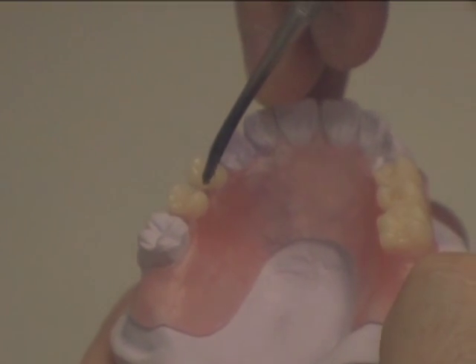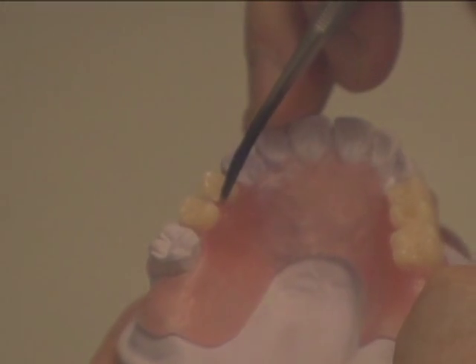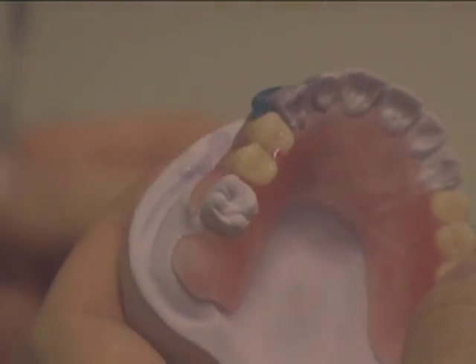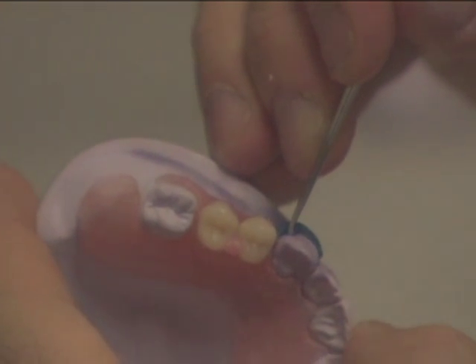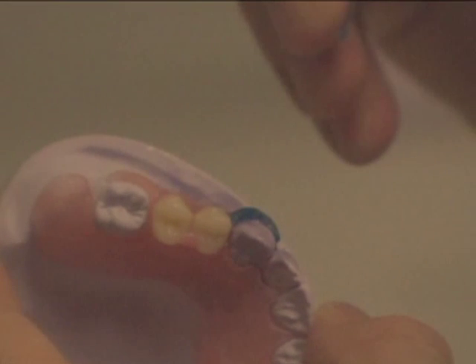Fill some wax into the buttonholes that you created on the tooth. Once you are done waxing, double check and make sure that your clasps are 2mm by 2mm thick. This is very important.